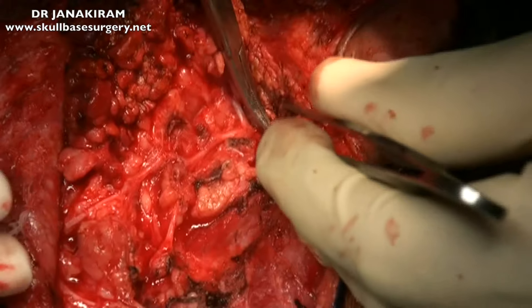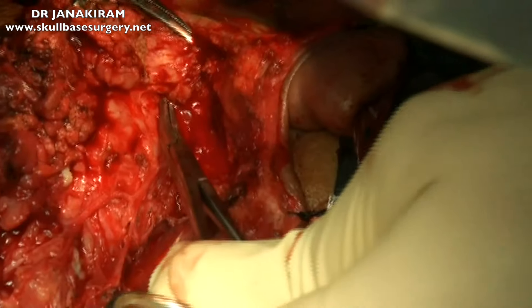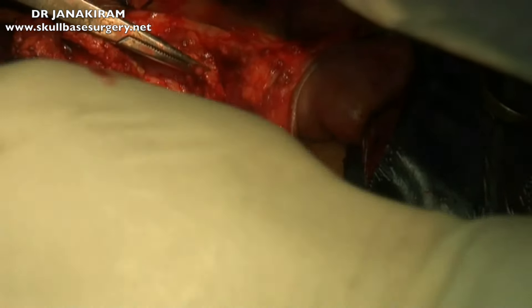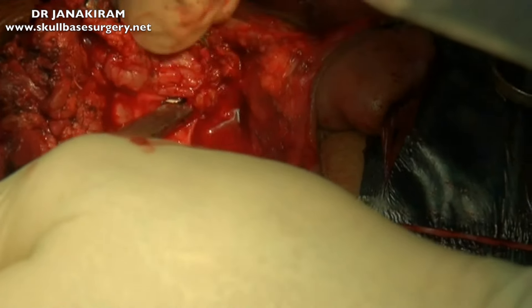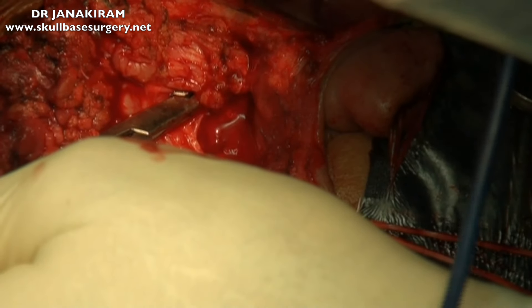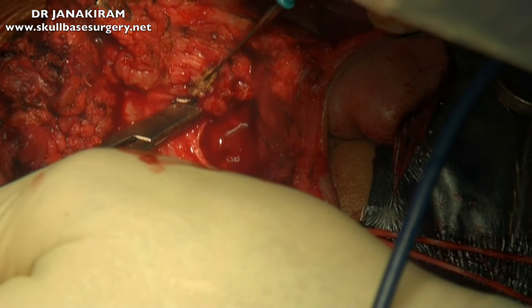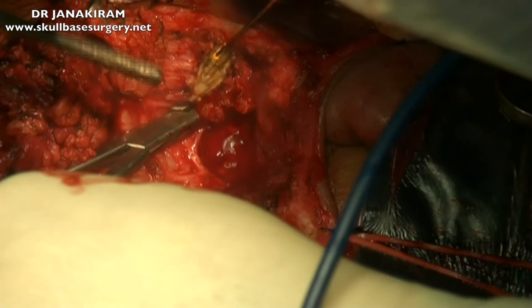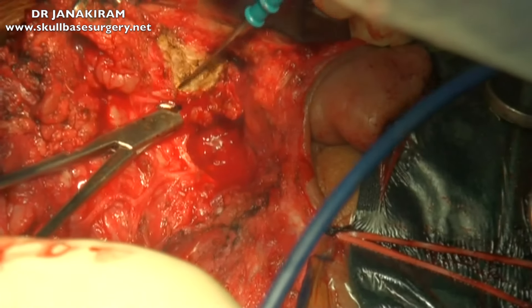Now you can see that the main trunk of the facial nerve has been identified. You can see the upper zygomatic or temporal branch again being dissected very beautifully with a curved artery forceps directed upwards. There was a lot of inflammation, so it was very difficult to insert the artery forceps. In inflammatory disease it is slightly more difficult to do a parotidectomy than in neoplastic disease like a pleomorphic adenoma, where it is very easy.